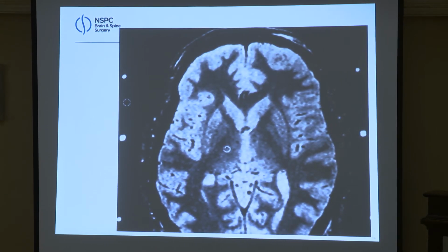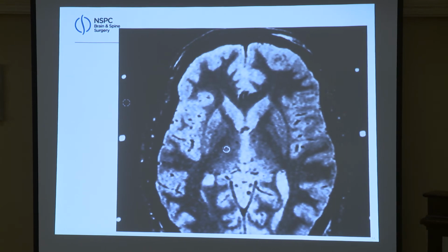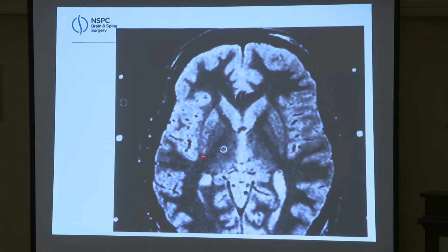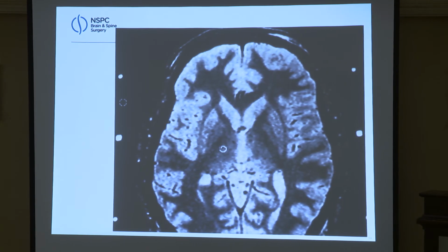One can do this with surgery, putting a needle in here, or one can do it with deep brain stimulation. Michael J. Fox had Parkinson's, and they did a thalamotomy to alleviate his tremor. They put a needle into his head and injured this nucleus. It can be done. If a person's not a good candidate for those things, one can do Gamma Knife and aim it right on that nucleus and improve the tremor. It could take several months. If one had it bilateral, you could wait a year or two and then do the other side.